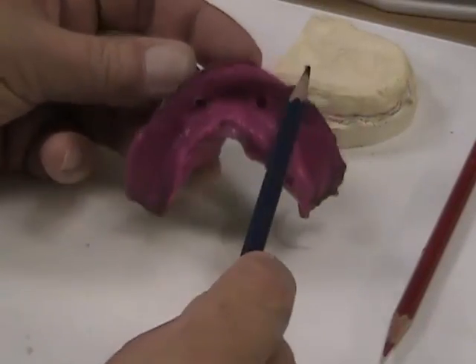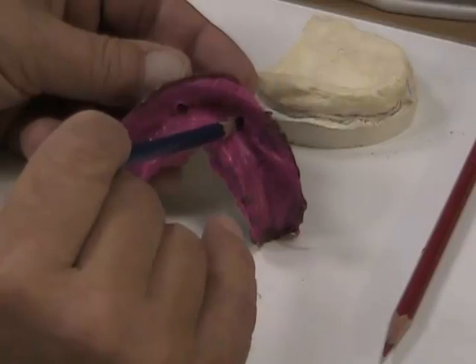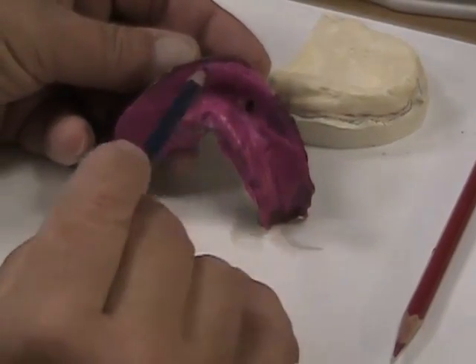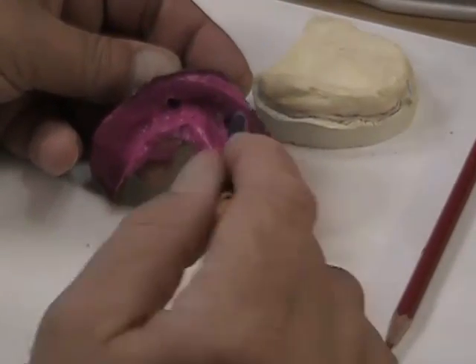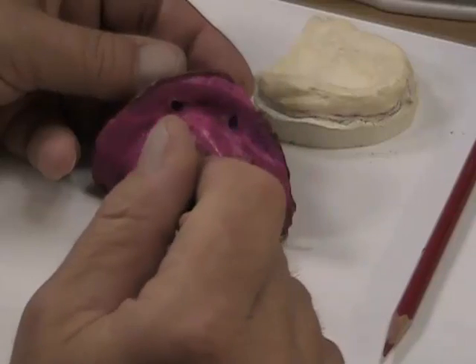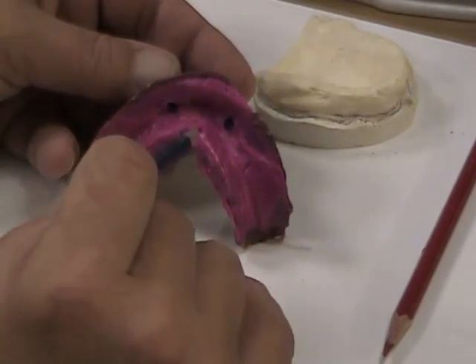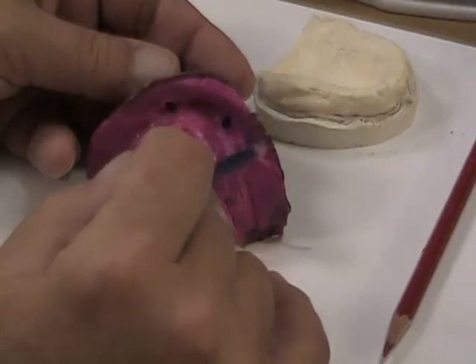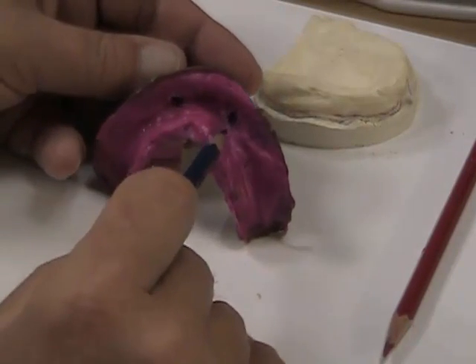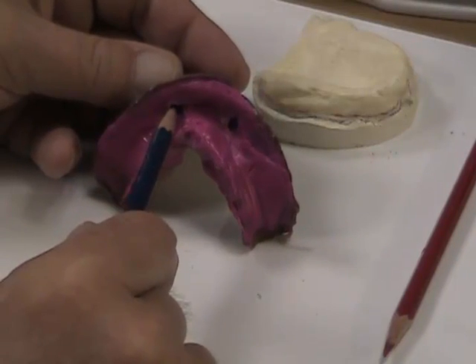The custom tray itself was already way extended and actually pushed that vestibular area down. Some people might see these two attachment locations here — I think they're probably ERAs or locators — and think, why didn't they do a pickup impression? We can take and process around these areas and allow them to do a chairside setting. But it is even more critical that this is an impression which takes into account vestibular support or tissue support. It's a good thing to have a well border molded impression, even more so, because these attachments are not supporting — they're retaining.